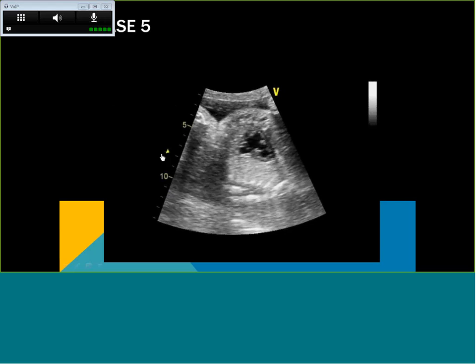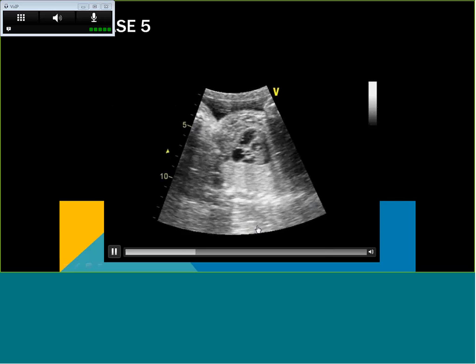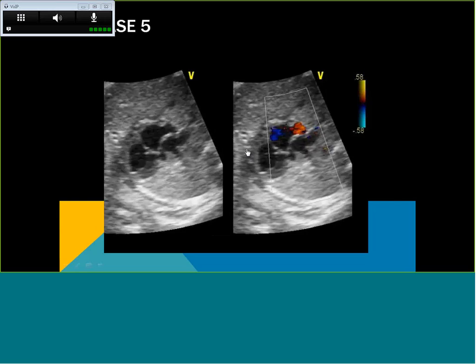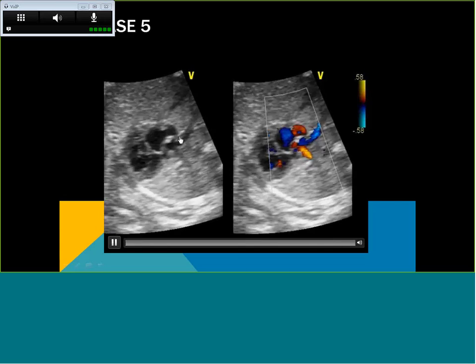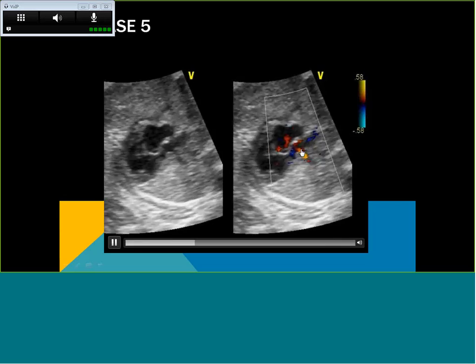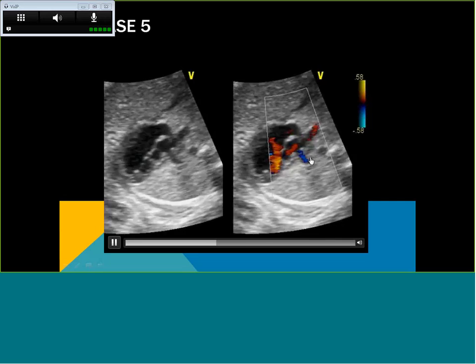And here we are. On the surface, this does not look tremendously different from the last case. Anterior, posterior, right ventricle, maybe a small hypoplastic left ventricle back here. But the important difference is here. So right atrium, left atrium, right ventricle. And you see here that there is an abnormally thick atrial septum. And this is going to turn out to be very important. Not only is the atrial septum thick, but these are the pulmonary veins here, 1 and 2. Obviously there are 4, but there are only 2 pictured here.